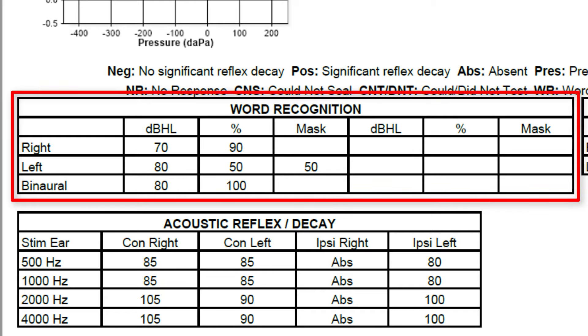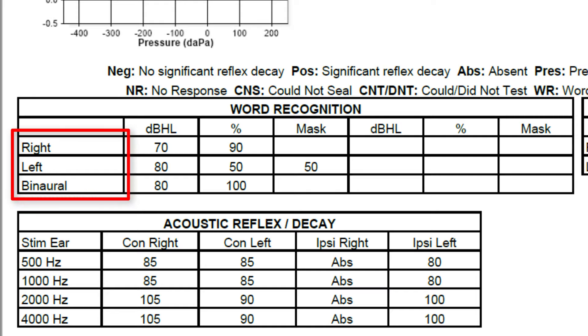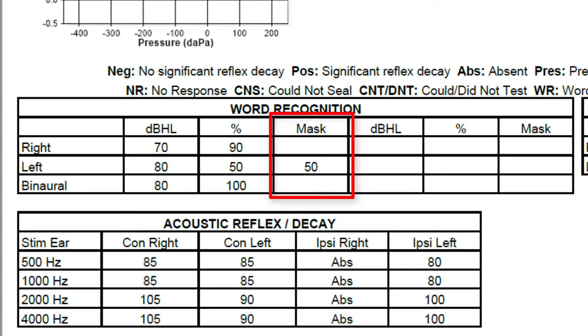Next, we're gonna cover word recognition scores, which are abbreviated WRS, which tell us your brain's ability to comprehend speech when we're actually overcoming your loss in hearing sensitivity with amplification. Your word recognition scores will often be found in your word recognition section of your audiogram. You will be able to see which ear was being tested, with the word binaural being used if speech was played into both ears at the same time. You will see the presentation level of speech in dB HL, your percentages of words correct, and possibly a number in the masking section which indicates how much static sound in decibels was played into the opposite ear to prevent it from assisting the ear being tested. The higher the word recognition score percentage is, the better you are at understanding speech when the words used during the test are amplified to a level that overcomes your loss in hearing sensitivity. You should care a lot about your word recognition score percentages because these percentages indicate how much benefit you should expect to receive from hearing treatment.